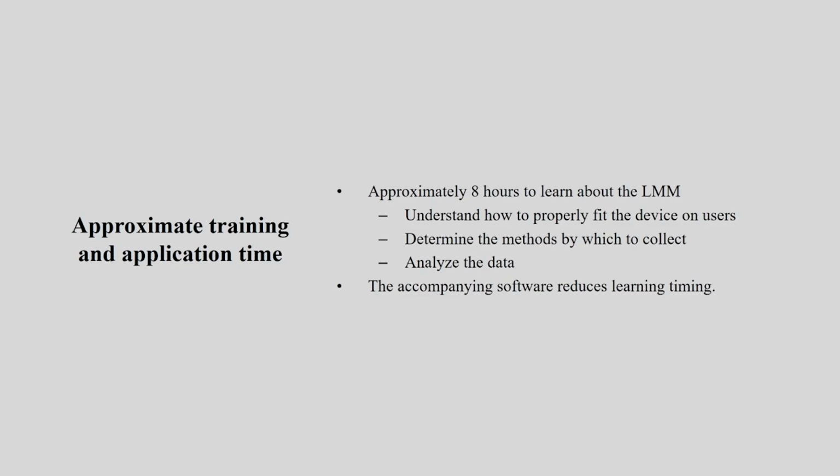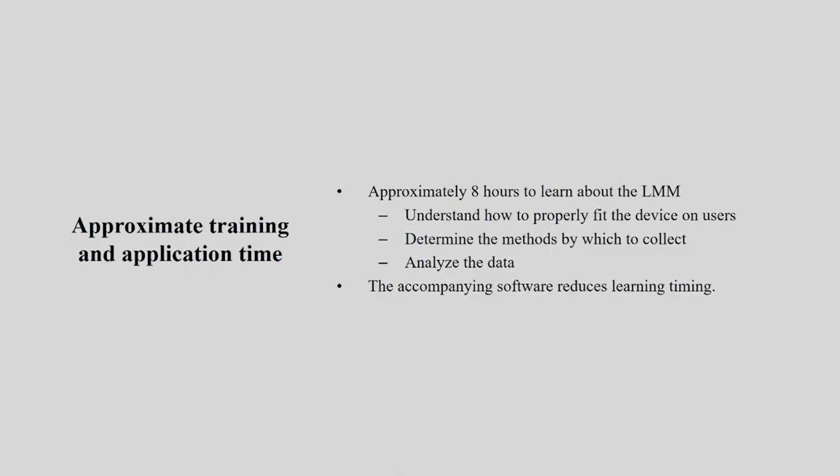The accompanying software reduces the learning time, but understanding that software also is an important aspect. So in total, if you look at this particular instrument, it is a little complicated. You really need some basic understanding of lumbar movement and all those things, then only you can use this particular instrument. So that's all about the lumbar motion monitor.